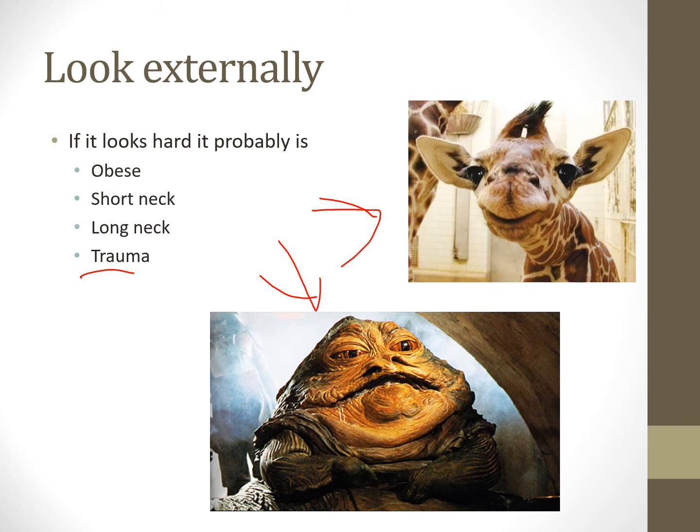I had that kid that came in that was hit by a vehicle on his bicycle, and his airway was so traumatic. There was so much blood all over it. He was intubated by pre-hospital, and they wanted to check to make sure his tube was in the right place. And under direct laryngoscopy with just the blade and the handle, they couldn't see anything. It was just blood all over the place. So we had to use a bronchoscope to verify that we were in the trachea. And at that time, we didn't have like the bougies or anything like that. That was a long time ago.